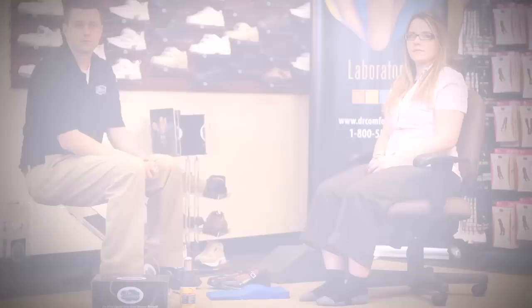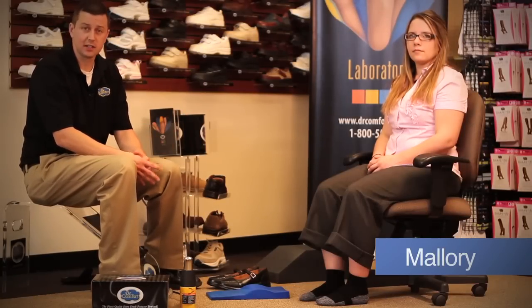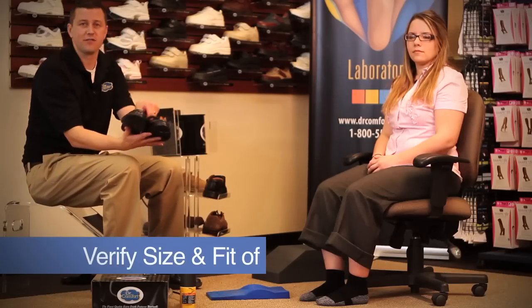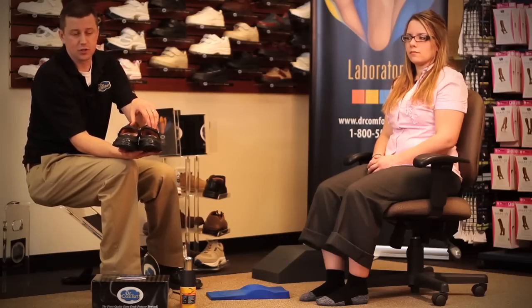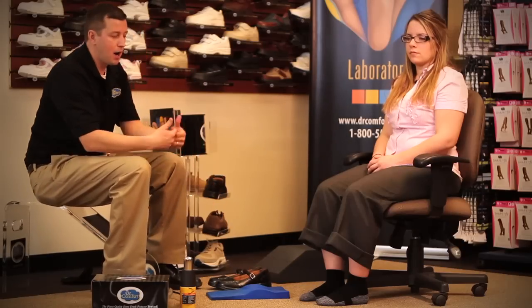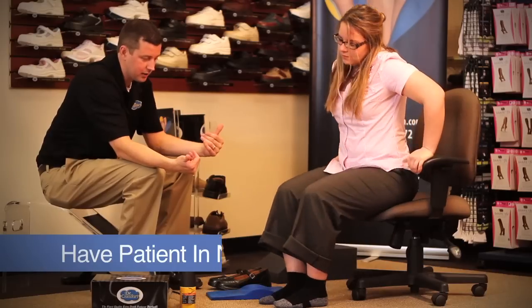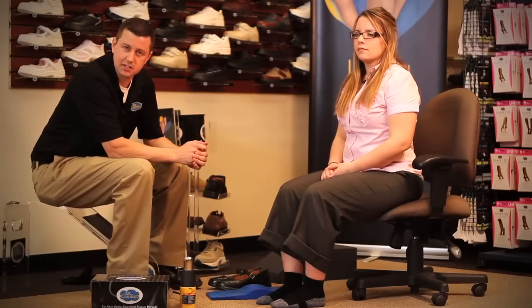Now I'd like to demonstrate on two patients the proper heat molding techniques for Medicare. For our first demonstration, we will be using Mallory from Customer Service to heat mold non-custom inserts using a heat gun. The very first thing you want to do is verify the style including the size and fit of the shoe, to ensure that the shoes and inserts are going home with that patient that day. The next thing is to properly position the patient — have them sit forward in the chair at a more neutral position to put a little more weight on the insert as it heat molds.